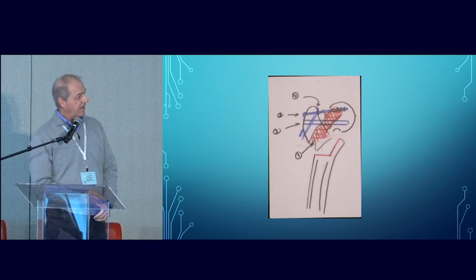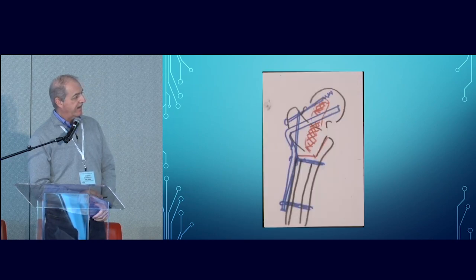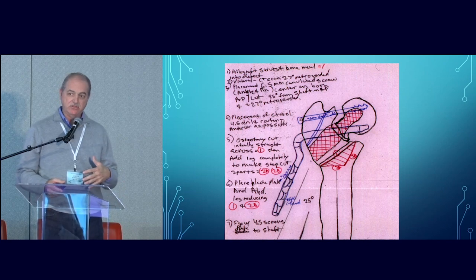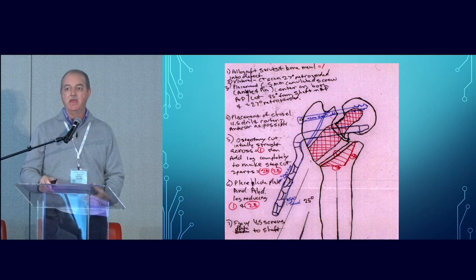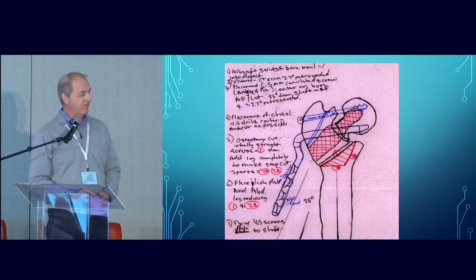But here's a part of the plan. Here's where the plate's going to end up, that derotation screw and the osteotomy that's going to be created. So it's not only about drawing pictures, and I used to have this great glass dining room table. One of the kids would be on my lap as I sketched out my x-rays on the tracing paper and such.